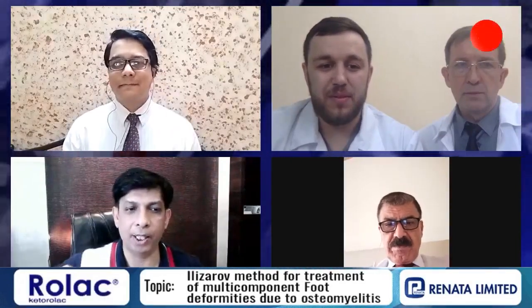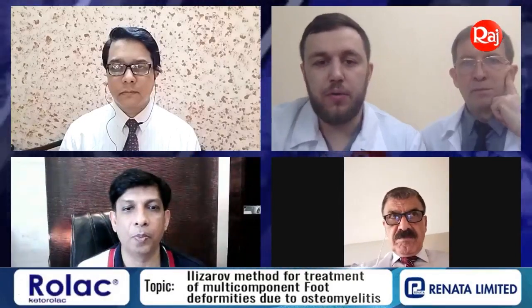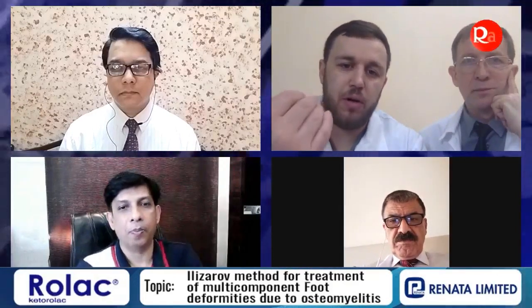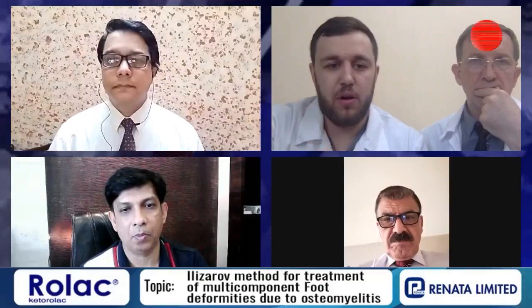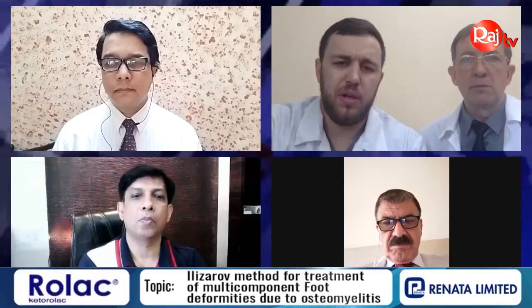One more question. You have created Equinus deformity for the soft tissue lesion. After the soft tissue healing is there and you correct the Equinus deformity, is there any wound dehiscence seen after that? Recurrence? No? No, if you do it gradually, I mean gradual correction, it can be safe for soft tissue, on the scar after the stitching wound. If you do it gradually with control, it will be okay.